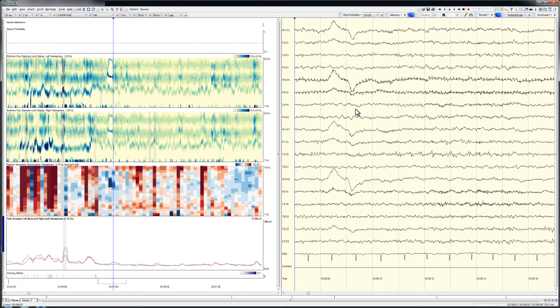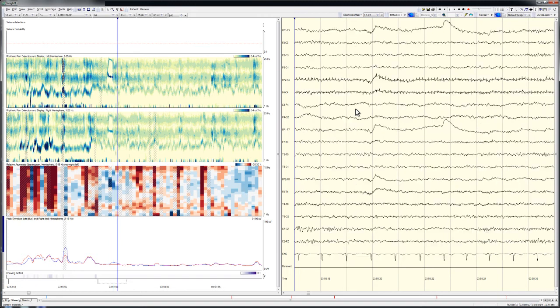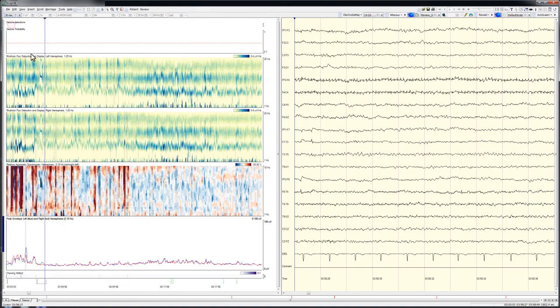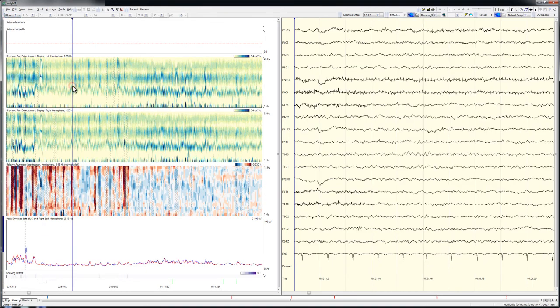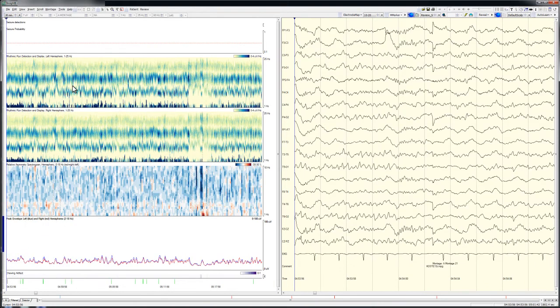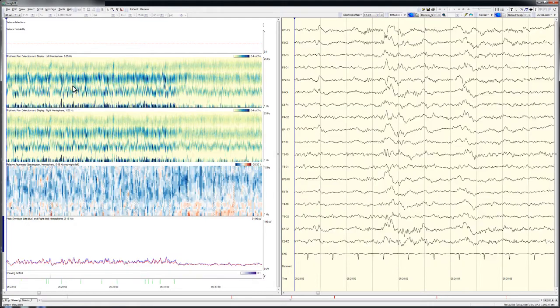Clicking just before that area and then paging through the associated EEG reveals fairly well-defined but low-amplitude alpha and beta patterns that evolve primarily over the left hemisphere. These patterns are consistent with the seizure, and by pressing a function key I mark the record for later detailed review.